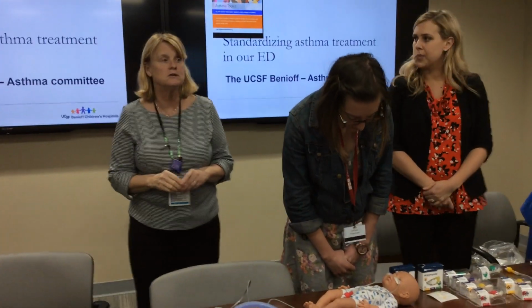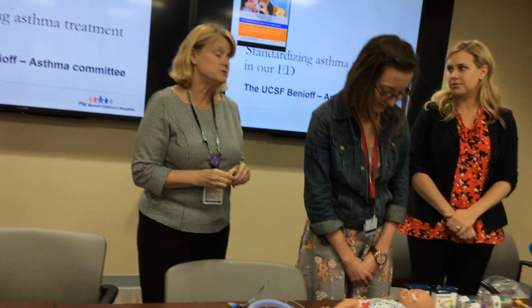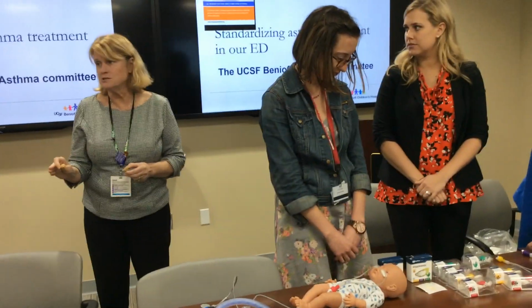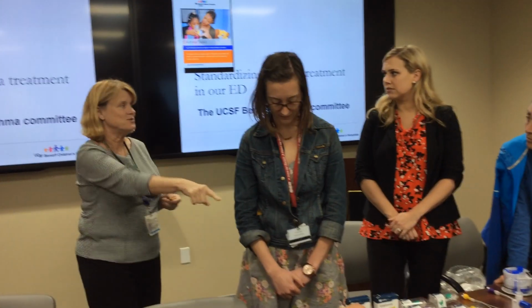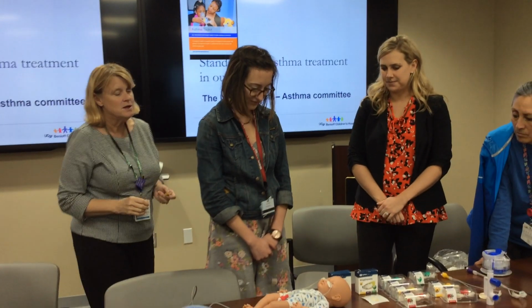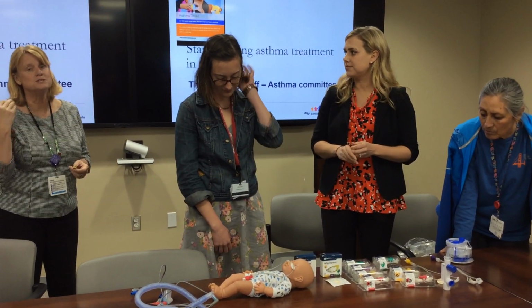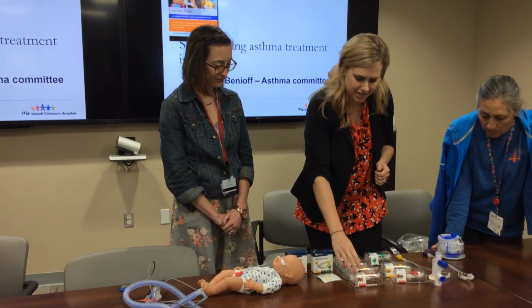In fact, it should only include up to, what did you say, three quarters? 50%. So that probably answers whoever asked about the suctioning thing too. She's going to tell you how you can do it. There's a little trick to it. But it does allow them to get their secretions out, and particularly the CO2. I'll let her take over here. Brittany's right, she's good at this.